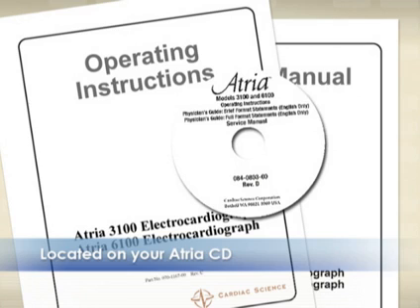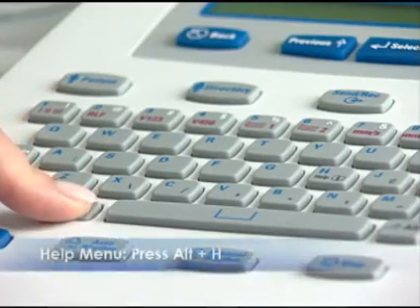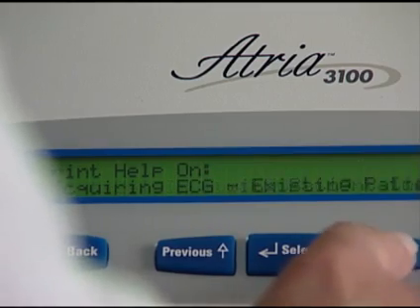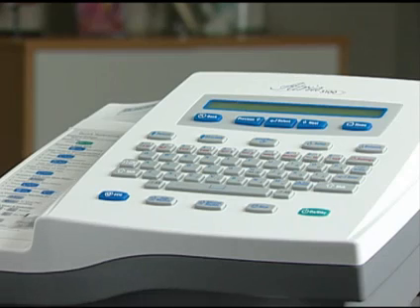For more options, see your Atria 3100 manual. Remember, the Help menu is a great resource. Simply press the Alt and the H keys. Then scroll down to the desired topic. Press Select, and the device will print out step-by-step instructions.